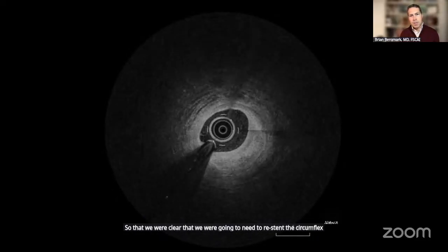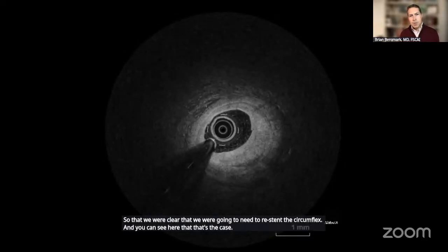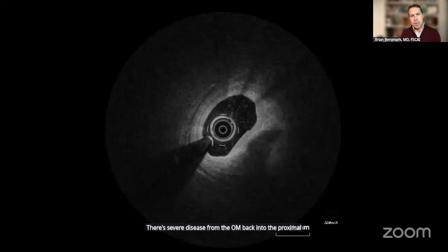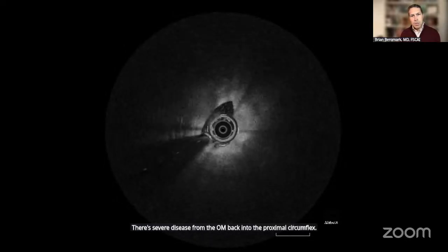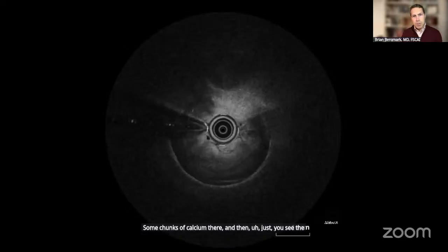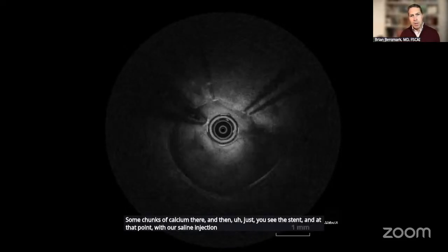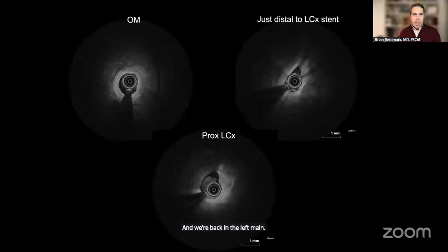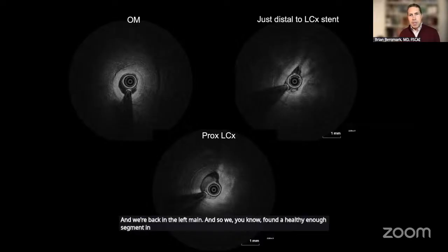And you can see here that that's the case. There's severe disease from the OM back into the proximal circumflex, some chunks of calcium there, and then you see the stent. And at that point, with our saline injection, we kind of run out of steam and we're back in the left main. And so we found a healthy enough segment in the OM. The prox circ is diseased, and we can sort of size all this.